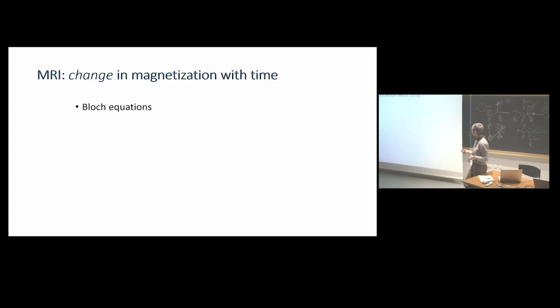More about that later, because we will consider one more thing. Now I crudely introduced to you something that I say is T1 relaxation and T2 relaxation, and you say, hey, what does that mean? In order to do that, we need to do a little bit of maths. We need to look at the Bloch equations. And what do the Bloch equations do? They simply describe what happens with this magnetization vector that we have been looking at on average after taking the vector sum over time.